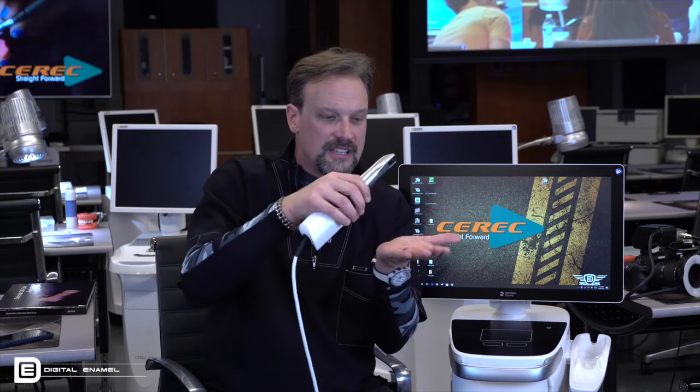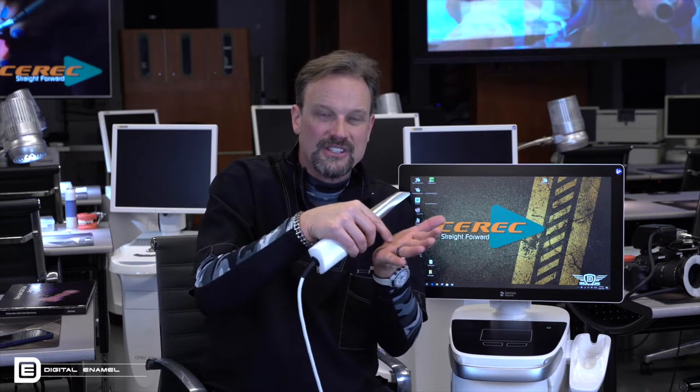But the thing is the tiniest little detail that it's trying to see, like the distal buccal of one of your margins that's barely exposed, and you're ripping this thing all the way across, you could potentially be giving it data that it has to extrapolate. If you just slow down a little bit and get in the sweet spot of the camera, your data is going to be fantastic.